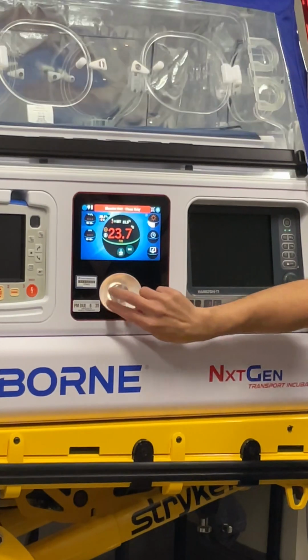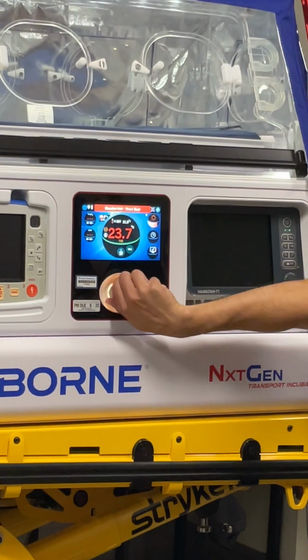So light touch that corner there, it turns on, turns brightness there.